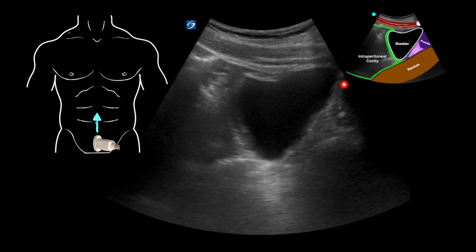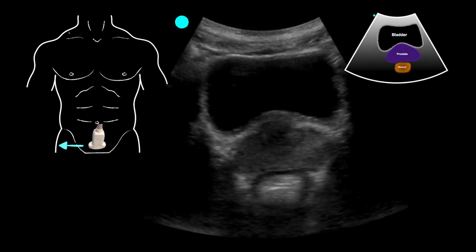When looking at this image, we see the prostate and seminal vesicles — that's the cutoff of the pelvis — and we look up into the abdomen for free fluid. Start in long axis to identify those structures, then look for free fluid along that wall. At times I'll do a short axis, especially in male patients, using the prostate as a landmark and then fanning or dragging superior towards the umbilicus to evaluate for free fluid.